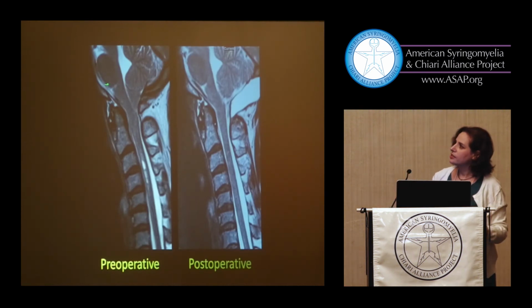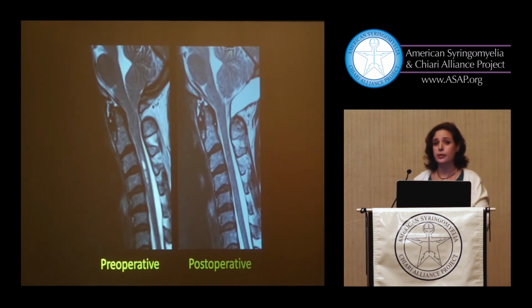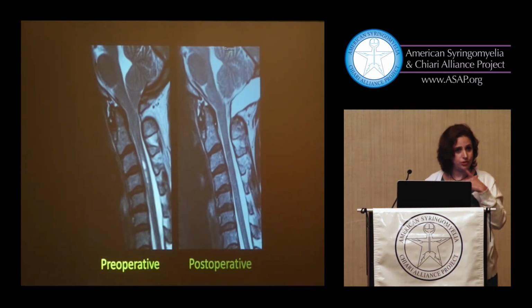Here's the case. This is a Chiari malformation with a syrinx. This is pre-op. Post-op, a little bit of a collection, but look at this. Syrinx is completely gone. This patient is doing great. I actually know this because she said she's feeling fantastic, and she looks great.